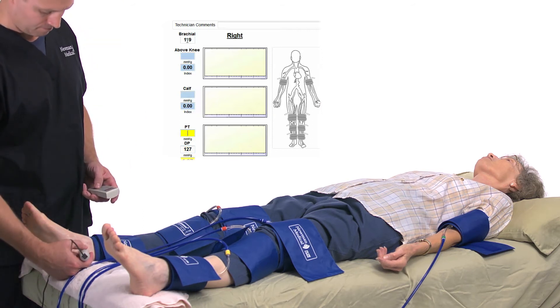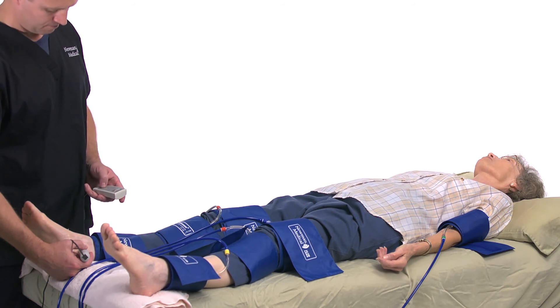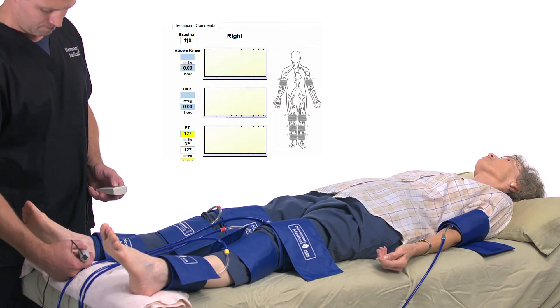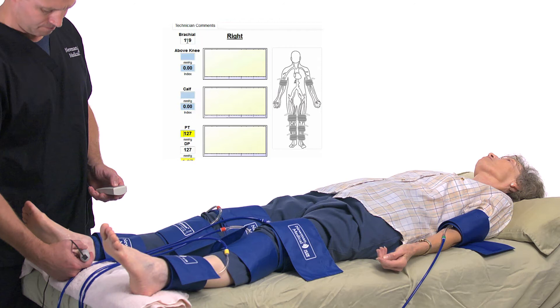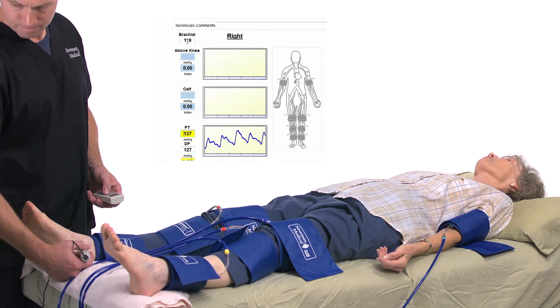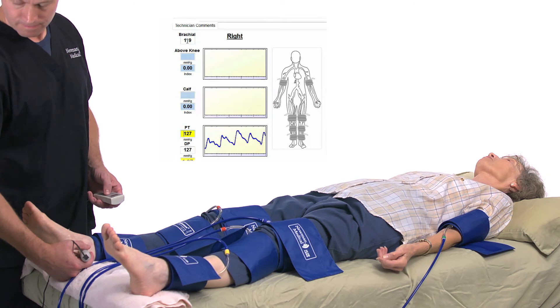Now press Next to move to the PT field. The PT artery is found roughly half an inch below and behind the inside ankle bone. Obtain a strong Doppler signal, then press and hold Inflate until blood flow occlusion plus 20 mm. Release and press Pressure when the sound returns, and the pressure will be entered in the PT field. Press Dump to prepare to take a PVR waveform. Press the button with the waveform image on the remote — the cuff will inflate to the proper pressure and hold while the waveform is obtained. Five seconds of waveform data is captured after the cuff pressure stabilizes at 65 mm.